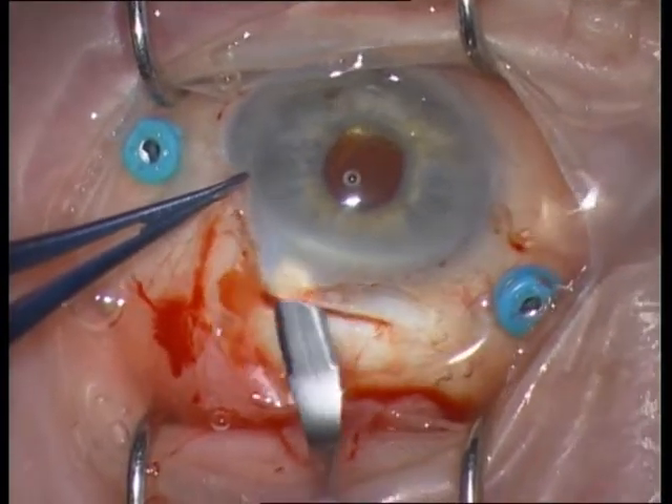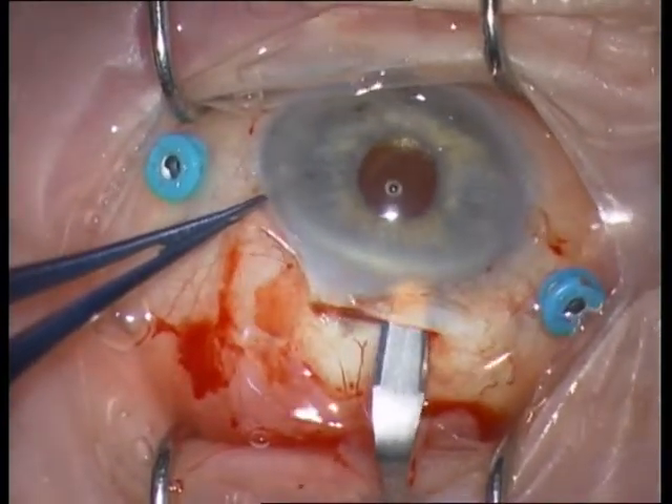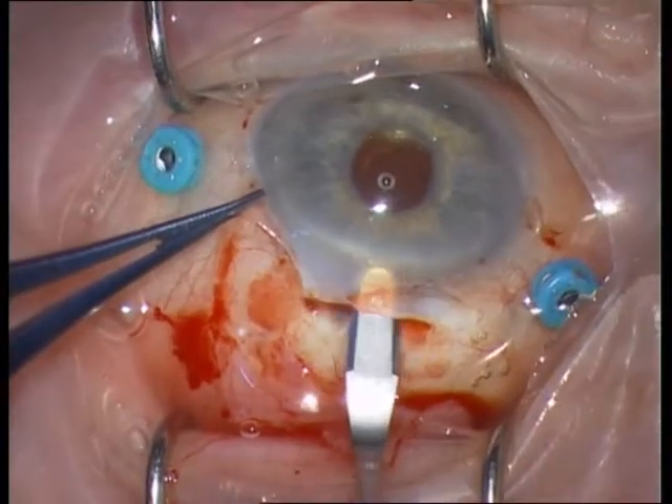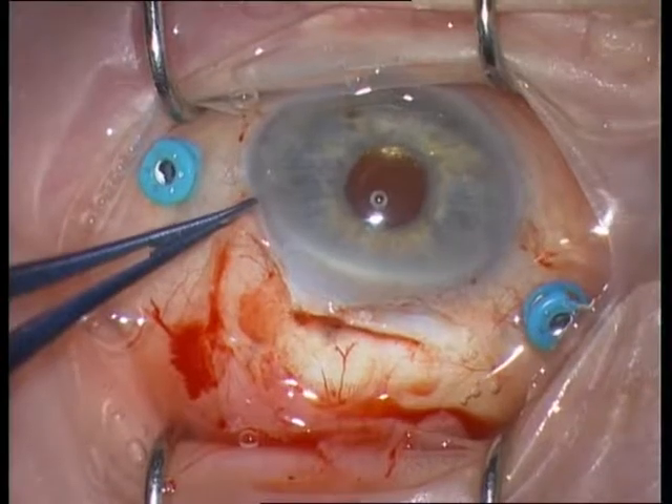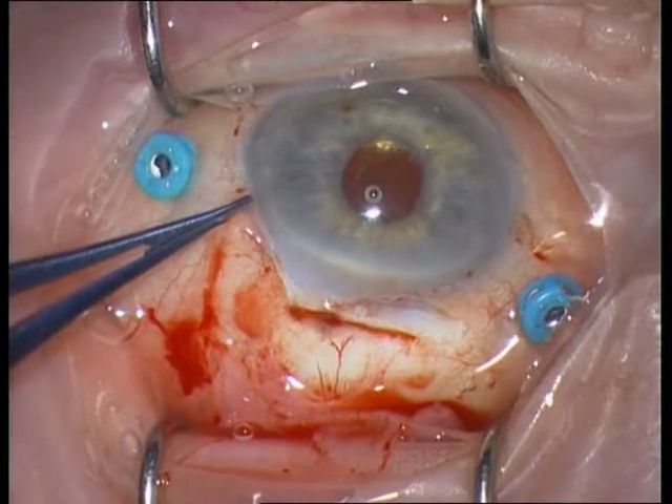This dissection is an important step. This is the perfect depth — you can see the knife shining through the tissue.